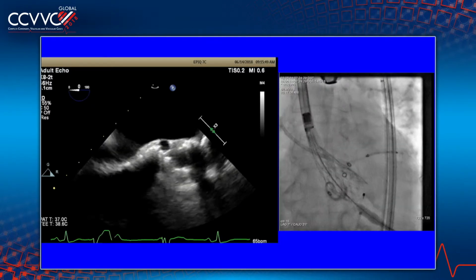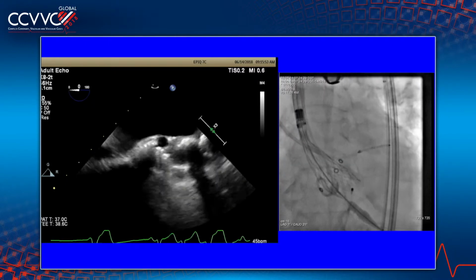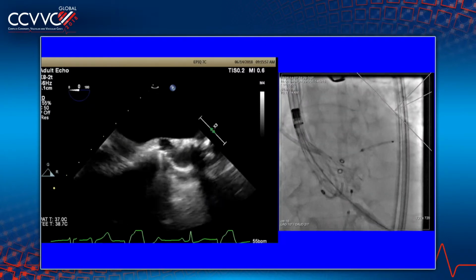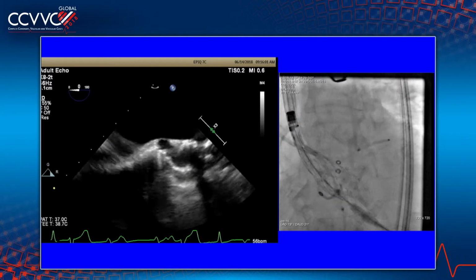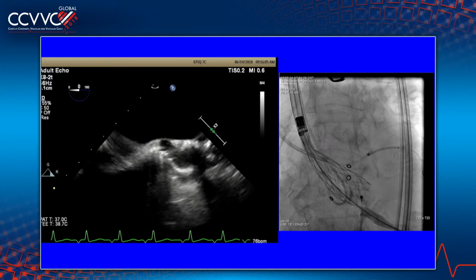I think you should do it again. No, look. Recapture. It looks okay. You're right. Take a parallax out and take a picture. Okay. Everyone like that position? I think it looks okay. Okay, we're taking a picture to see whether the thing here looks good or not. It looks good. Inject.